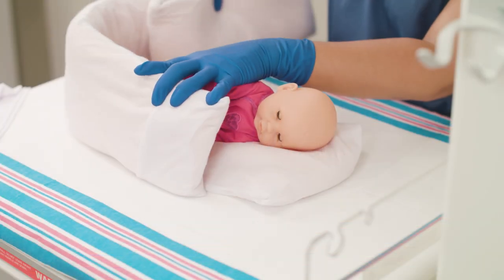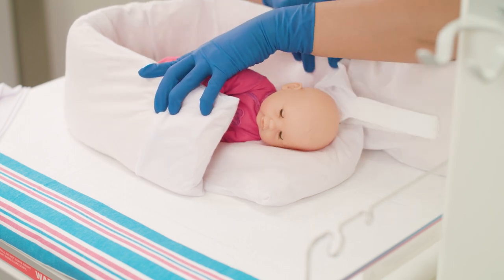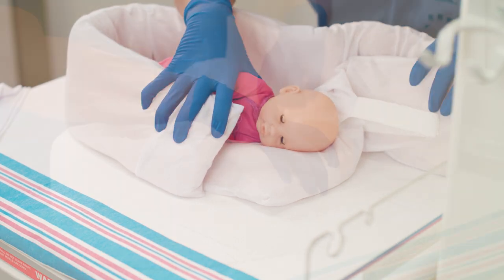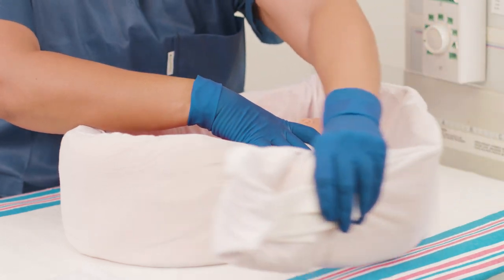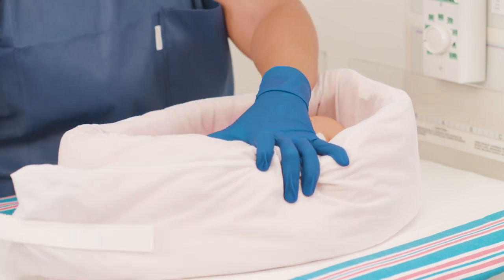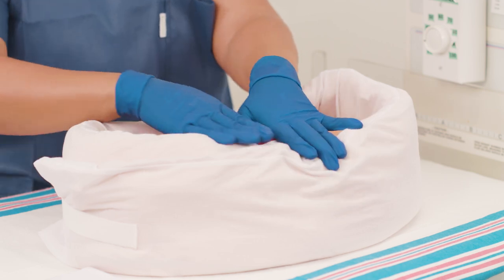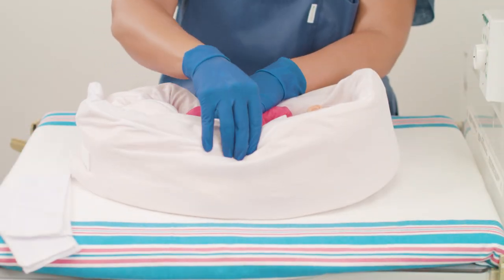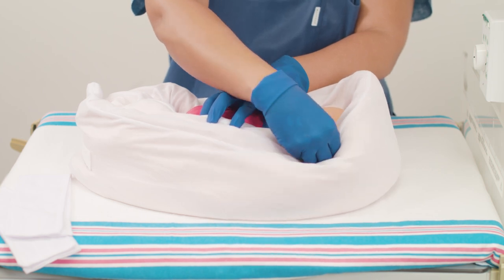Place the tube around the positioner, enclosing its perimeter. Mold the tube around the baby on all sides, ensuring the baby is in a flexed midline position with the hips and knees flexed. Secure the tube with the attached strap. Mold the tube so it provides clear access to the face. Note that you can create channels for medical equipment.